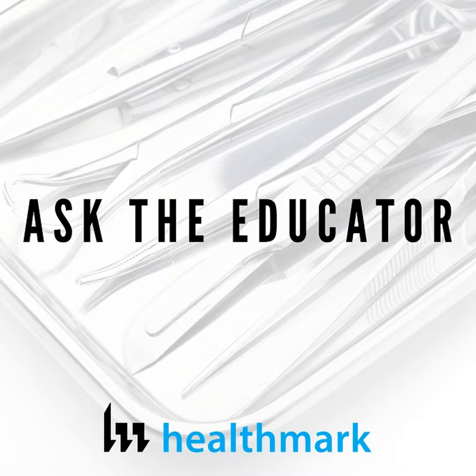I fall back on it a lot, but I used to work in the operating room. If we didn't have a basic cautery machine in every single OR, the surgeon would lose their mind. You would have to go to some storage area to find one, or poach from another OR. That would be unheard of. And this is the kind of thing that in our SPD today should be common equipment. It should be at each station, just like an insulation tester should be at each station. If you don't have it there, you're just increasing the chances that the step's not going to get done.